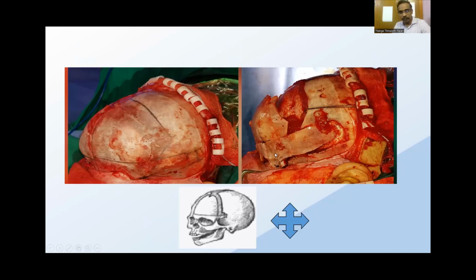So this is the orientation here, a little bit confusing. See the previous skull which I put down. This is for the guidance. So this is how the patient was. This was pre-op. You can see the orbital roof. These are the cuts we have planned. See the skull. This much we are removing. This much we are advancing from here to here. So this is after the advancement. You are seeing from the side how many centimeters we have advanced as calculated.